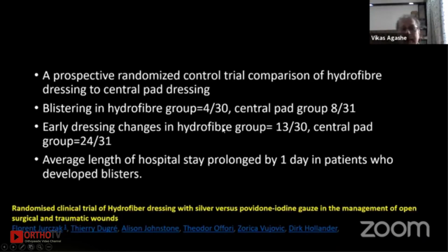Another study has also said that blistering is much less with these recently introduced occlusive dressings.